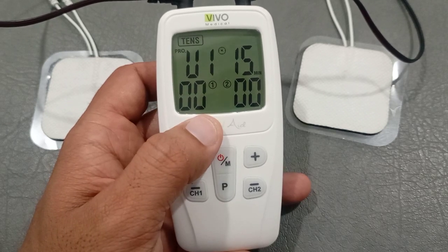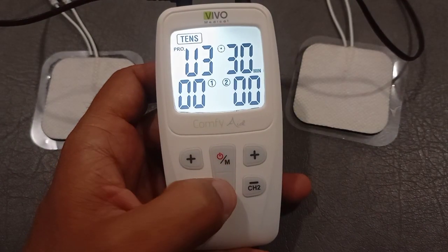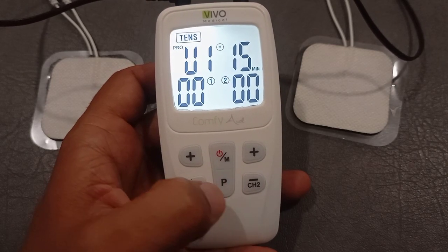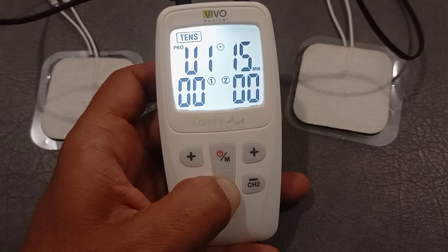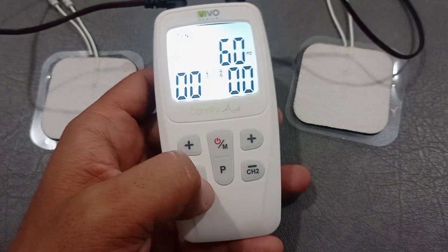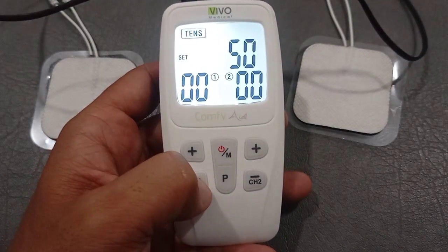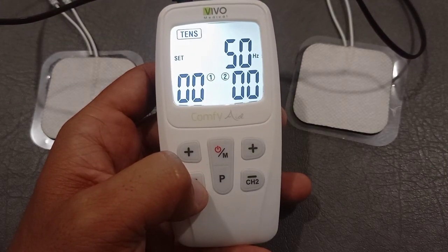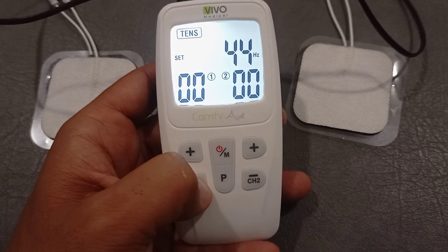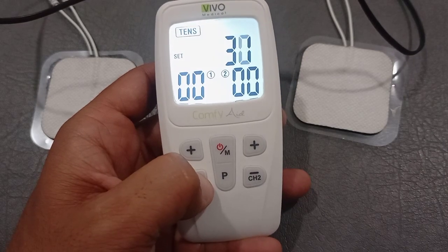So the parameters are really very simple. If I press this for a certain period of time, let's try to customize it. If I press this P for a longer period of time, here I can set the frequency, which is right now set to 60 hertz. I can reduce it. Above 50 it is high frequency. If we keep it at high frequency, then we need to stimulate at lower intensities, and below 50 hertz we need to stimulate at higher intensities. So first we need to set the frequency, or the pulses per second.